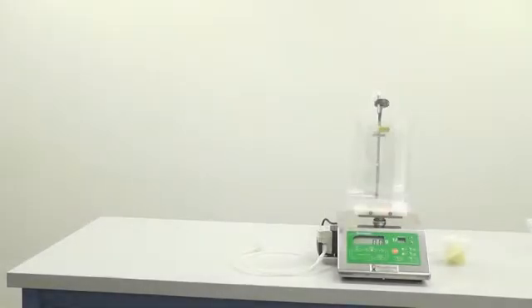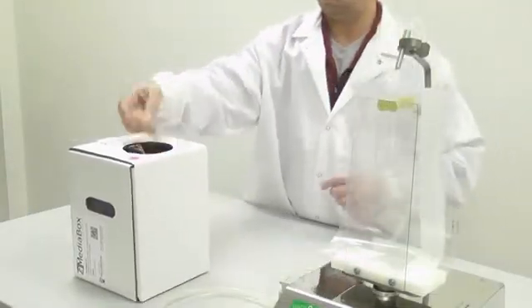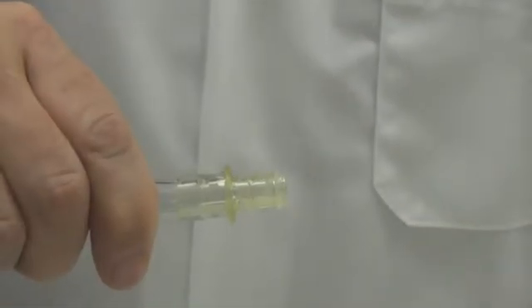MediaBox consists of a collapsible bladder in an easy-to-store box. MediaBox includes sterile tubing and an adapter which rapidly connects to your dispensing system. The adapter provided is autoclavable and is compatible with standard 6 or 8 mm tubing.